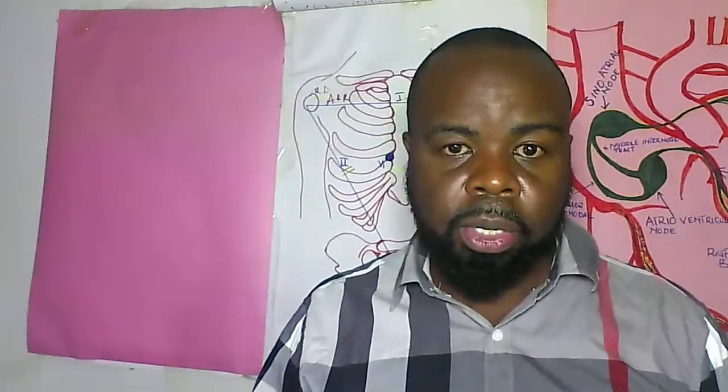Yes, welcome today. There is a topic that we didn't do, and we're going to do it. We're talking about EKG. EKG is a tool used to interpret the electrical pulses of the heart, and it is used to diagnose heart conditions. We didn't do that, so today we are going to learn about some things.